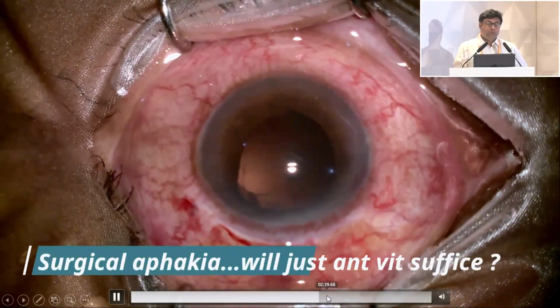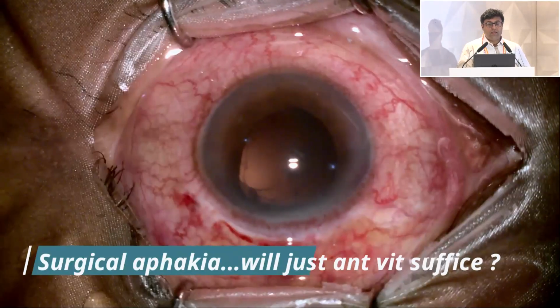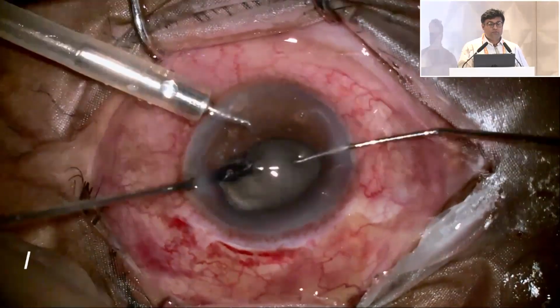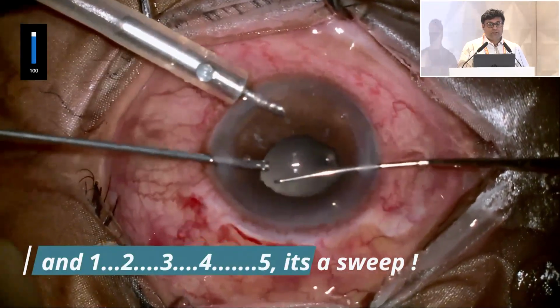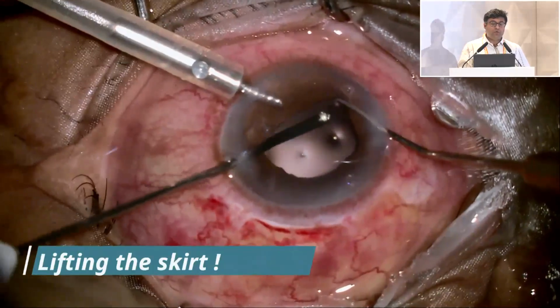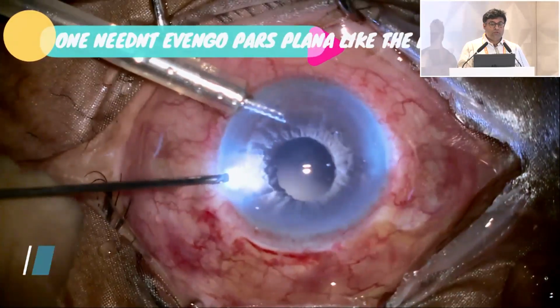Okay, so this is again a little out-of-the-box kind of thinking, wherein I did do an anterior vitrectomy. I made 3 ports. I did a triamcinolone staining of the anterior vitreous and tried to push as much of the vitreous back into the vitreous cavity. By removing those strands that have gone to the wound, I lifted the iris skirt as well, and tried to remove every little strand of vitreous.